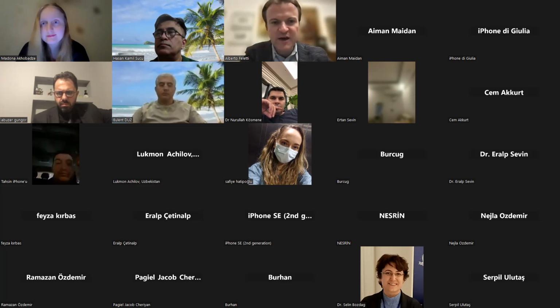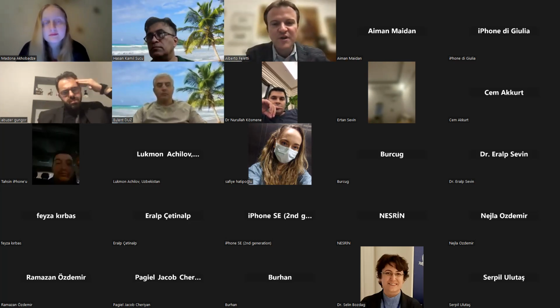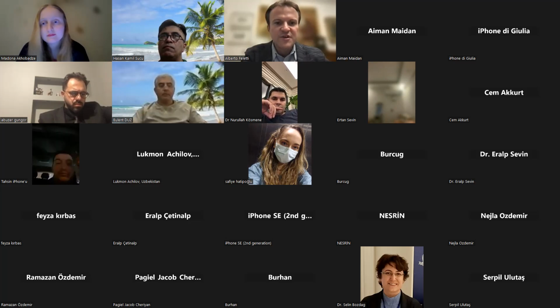And the position of the burr hole, it depends. If you use a flexible scope, you don't need neuronavigation, and the burr hole can be placed at the usual Kocher's point, modified if you have to enter the cerebral aqueduct. As I said, you have to place the burr hole a bit more medial. But if you have to stay only at the level of the third ventricle, the burr hole at the Kocher position is always good. Of course, if you decide to use a rigid scope, I encourage the use of neuronavigation. Thank you.